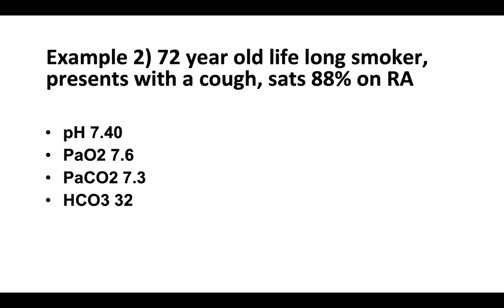PaCO2 of, yeah, so hypercapnia. PaCO2 of 7.3, anything over 6 is high, okay? And the bicarbonate is 32. Normal bicarbonate is 22 to 28. So you would say that the bicarbonate is high, low, or normal. What would you say? High, exactly.